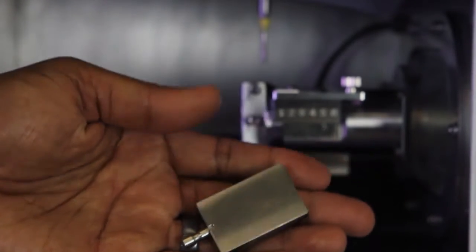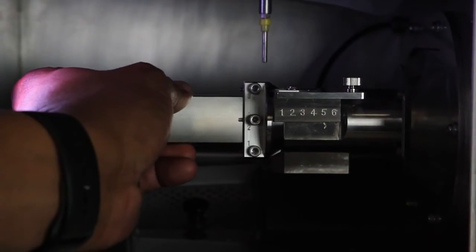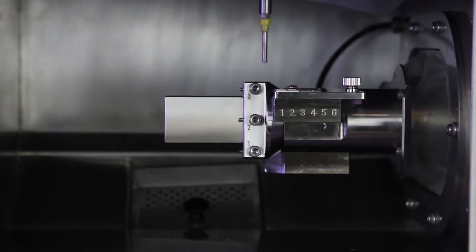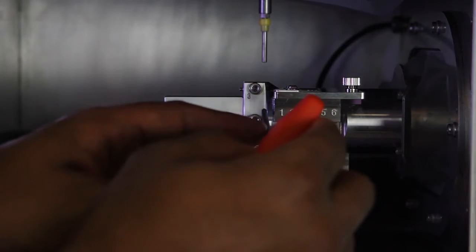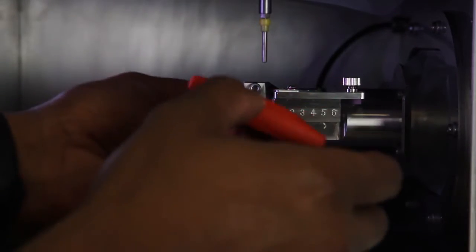Then, insert the automatic correction jig. Check to be sure there is no gap between the edge of the correction jig and the mounting part. Tighten the mounting screw with the hexagonal screwdriver to secure the position of the automatic correction jig.